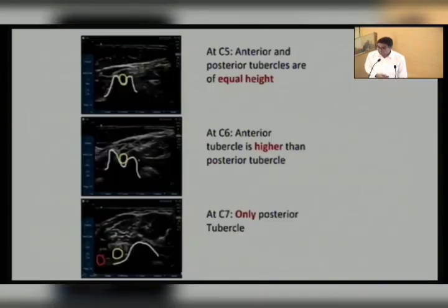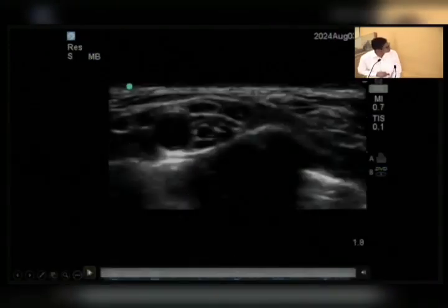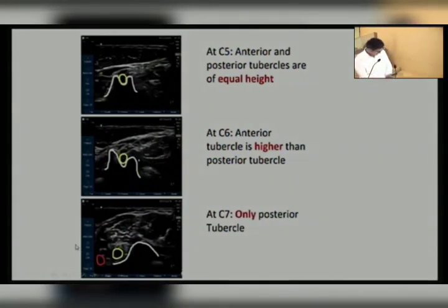These numbers can be identified by the presence of a tubercle on the transverse process of that particular vertebra. Like in C7, there is absence of the anterior tubercle, so we will find the vertebral vessels. This is C7 because of the absence of the anterior tubercle over here. Here two tubercles are seen, so this is C6. Subsequently, when we go cephalad from C7 to C6, and further cephalad, C5 also has two tubercles. So this is the way we can identify the number of roots.